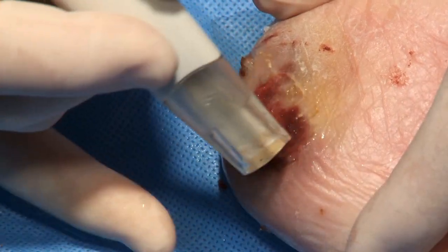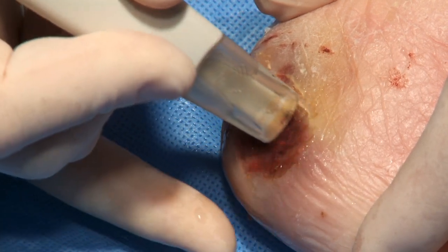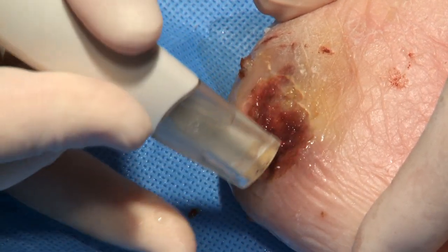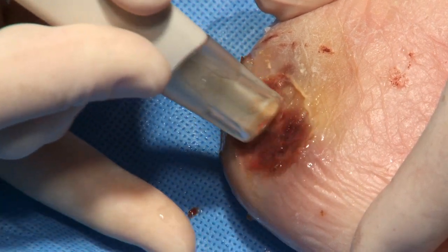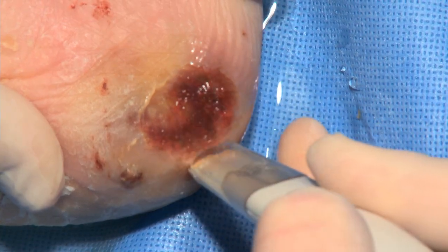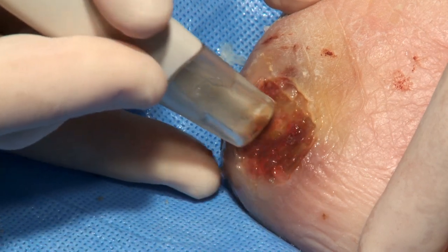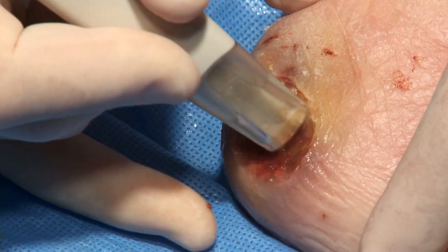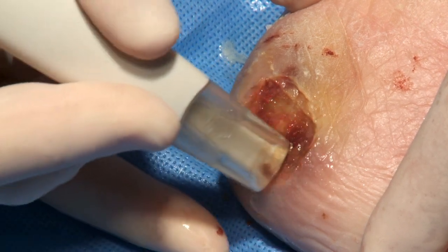Integrated suction allows for easy removal of unwanted debris from the surgical site. Keep the device in continuous motion while in contact with target tissue. If the handpiece is stationary or dwells on tissue, injury or excessive tissue removal may occur. Always pay close attention to the depth, orientation, and coverage of the device and to its proximity to surrounding untargeted tissue.